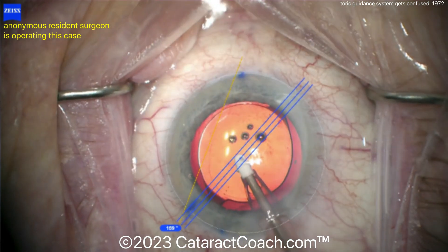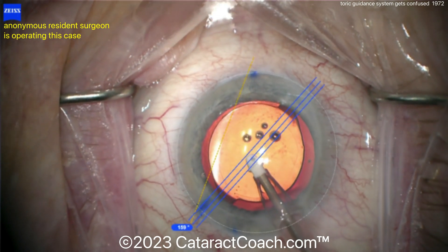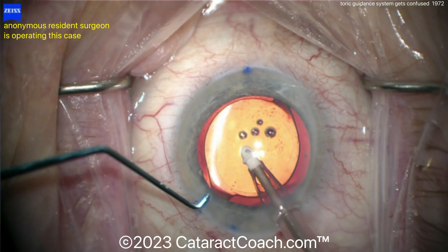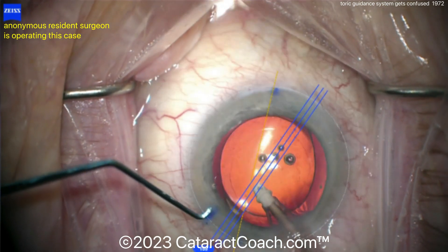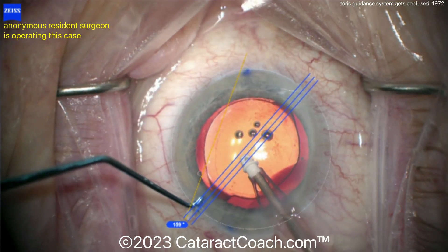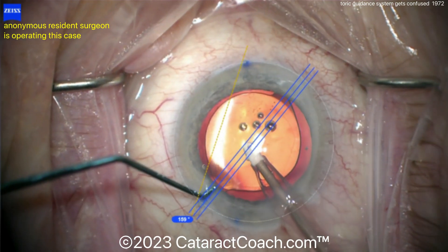Believe it or not, there are microscope manufacturers out there who will give you a blurry video like this in 720p and try to sell it to you as high definition. You need to avoid that situation. Before you purchase any microscope, stop and make sure that it actually outputs 1080p video. By the way, you can buy a 1080p camera on Amazon for like $20.